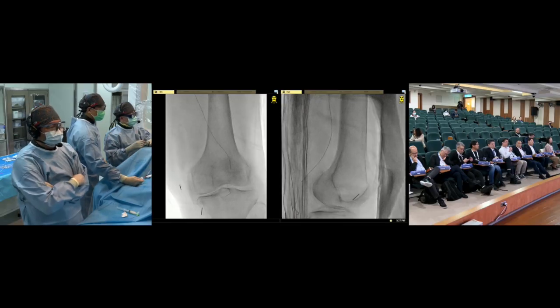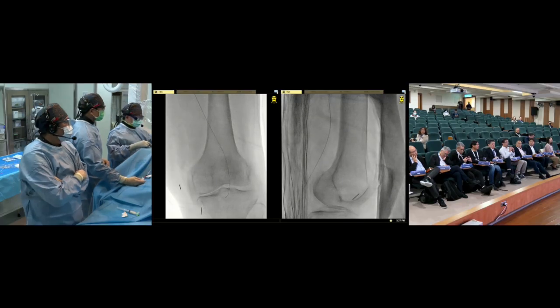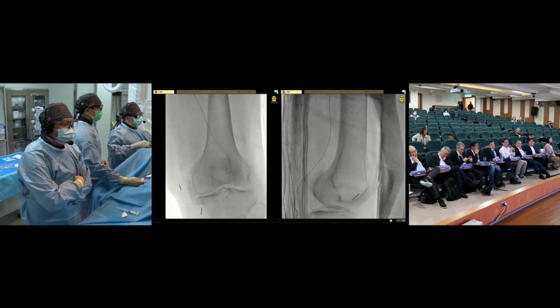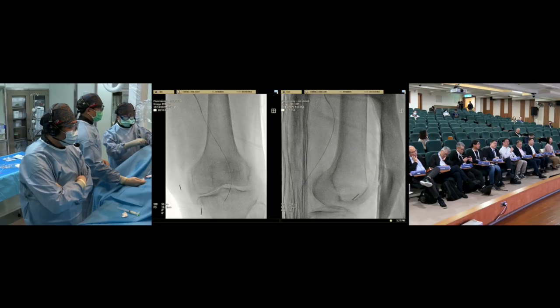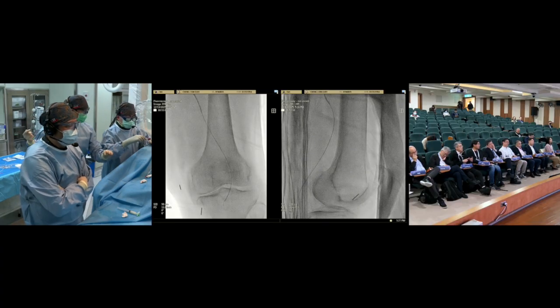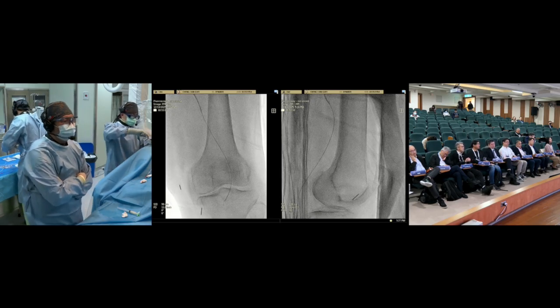Oh, sorry, maybe I misunderstood. So this patient used the temporary agent. Yeah. Okay. And we super selected the vessel, and we already embolized the descending genicular artery. Now we are going to super select the other genicular arteries.